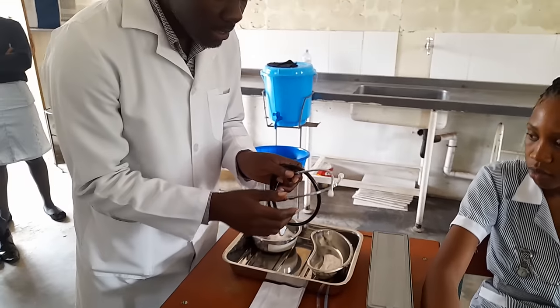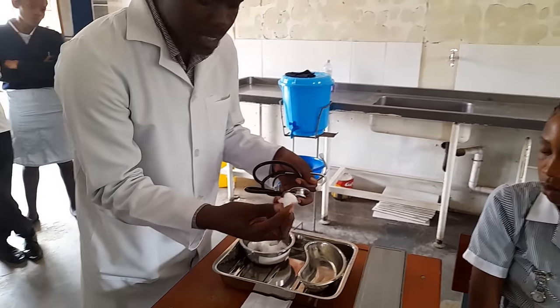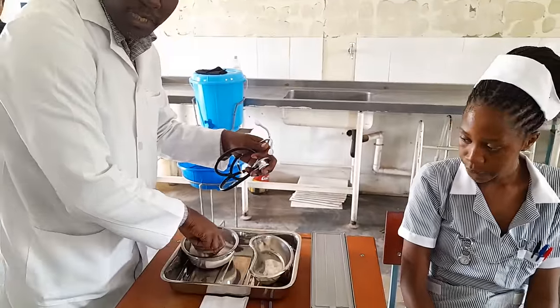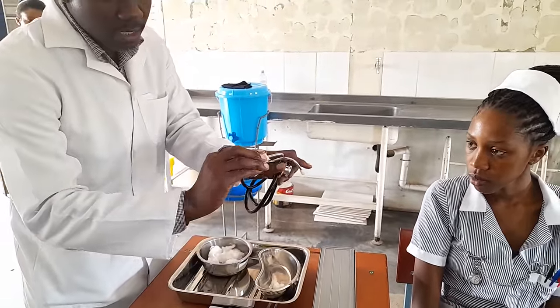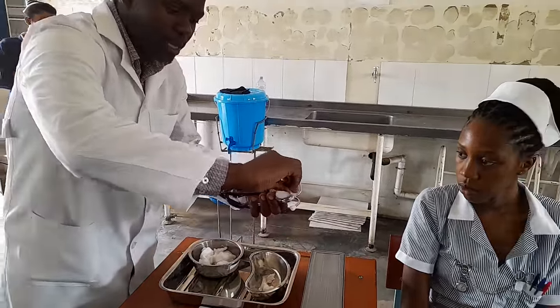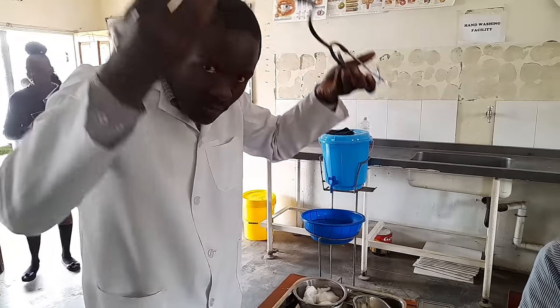You have to clean the stethoscope with spirited swabs. Each swab cleans each part of the earpiece, then discard. You can also clean the diaphragm — if the diaphragm is dirty, clean it like that, then discard. You can put the stethoscope where it's comfortable for you, usually around the neck so it's ready for you.